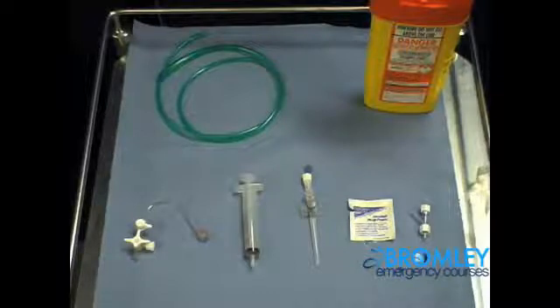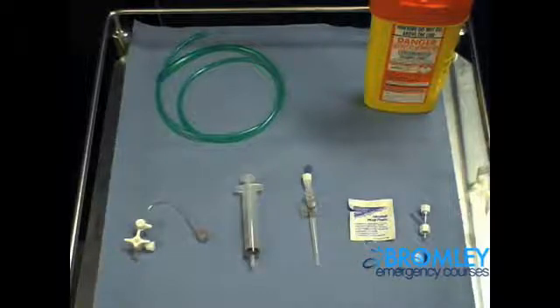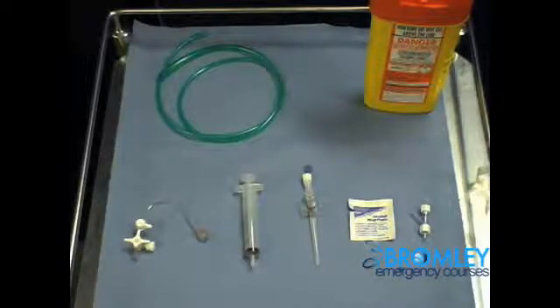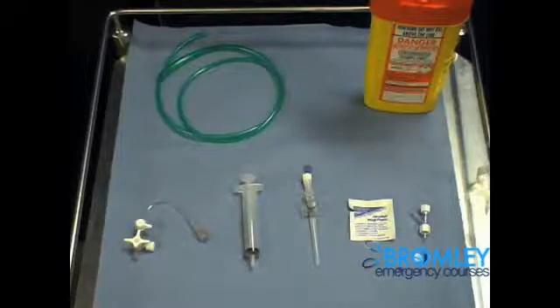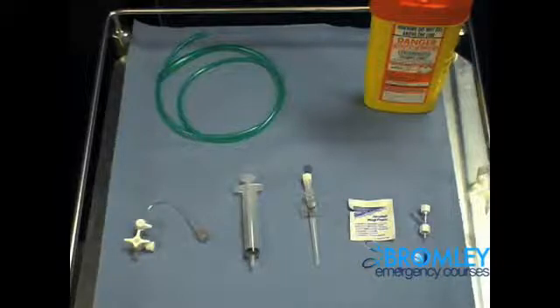Take time now to familiarize yourself with the equipment shown above, as well as refreshing your memory of the anatomy of the neck.